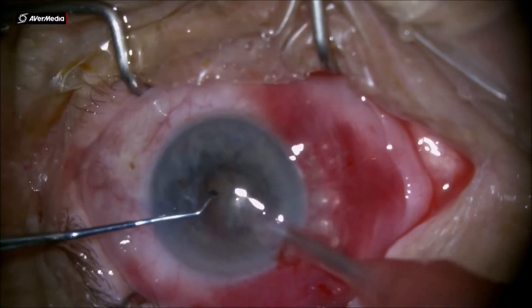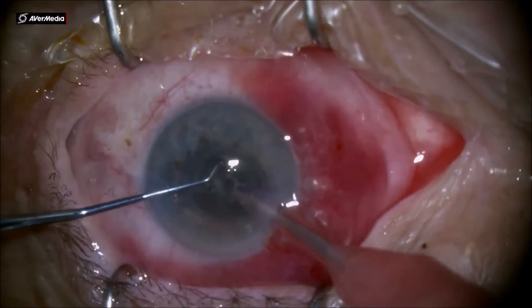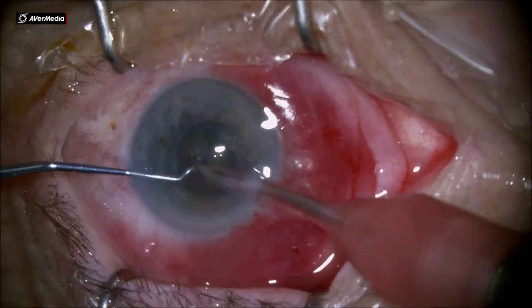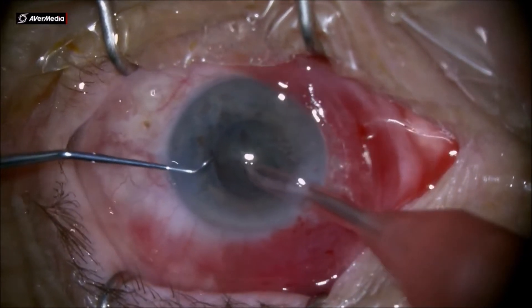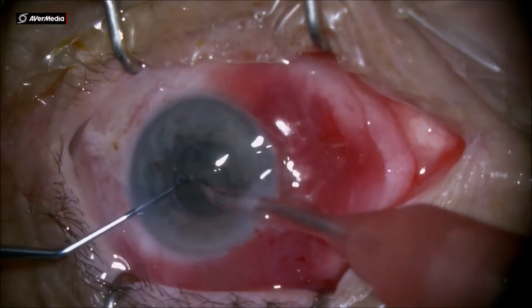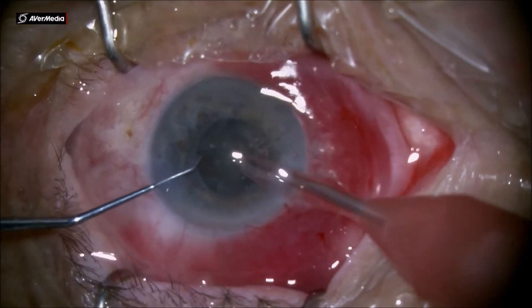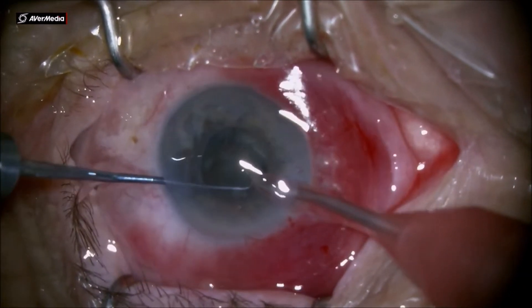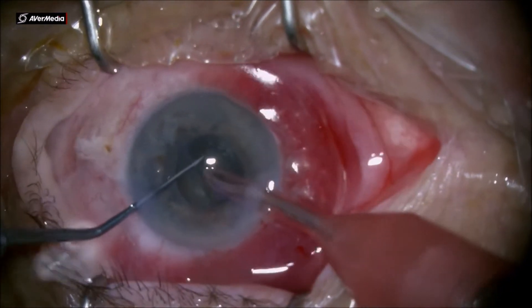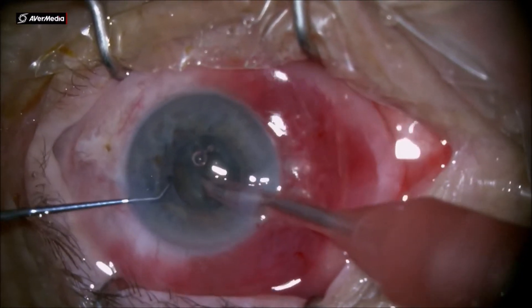Starting to aspirate the cortex in the middle of the pupil and then do a stop and chop technique. With this Mishev chopper, which has a spatulated tip, it is very easy to crack and separate the segments. I do another trench here like a Y-shape letter, so I'm able to take out a small fragment of that half of the hemi-nucleus in order to make some room inside the bag. In this way it's very easy to rotate the nucleus and have the two parts very well separated up to the posterior plate.